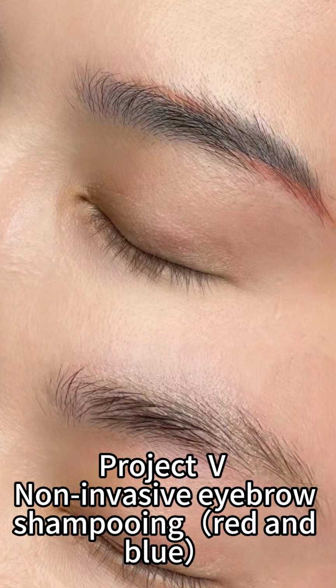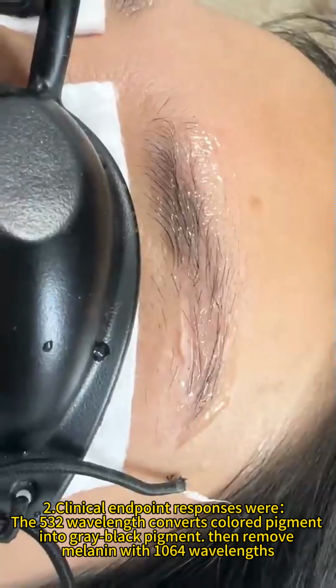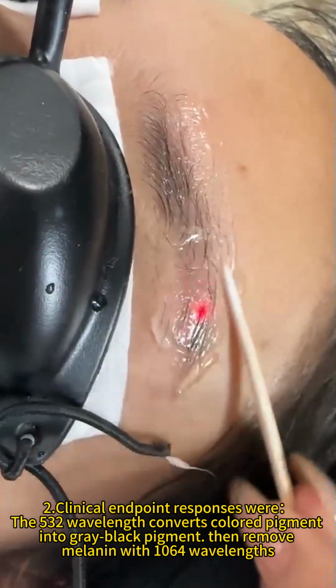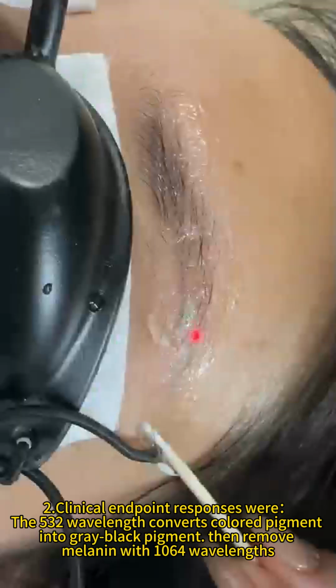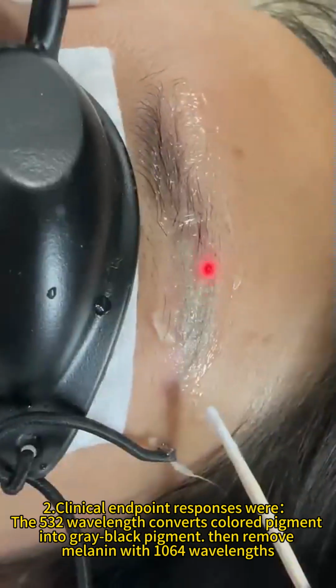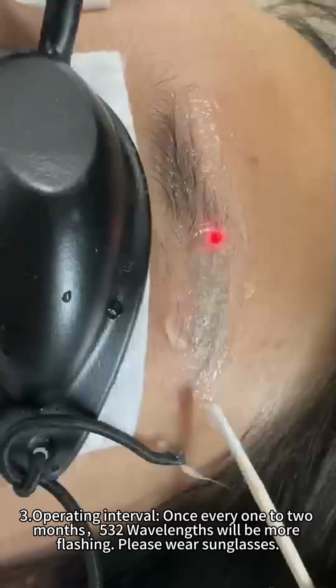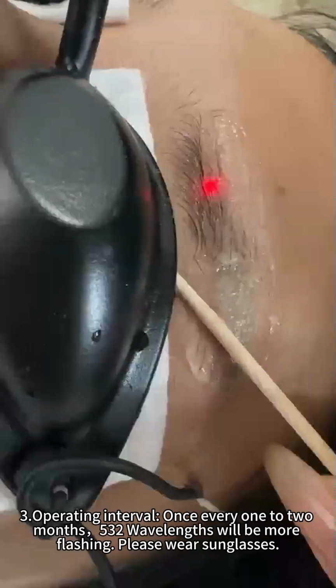Project 5, non-invasive eyebrow shampooing, red and blue. Recommended starting parameters: energy from 1.5, spot 8 to 9, frequency 1 to 2, wavelength 532. Clinical endpoint response: the 532 wavelength converts colored pigment into gray black pigment, then remove melanin with the 1064 wavelength. Operating interval, once every 1 to 2 months.